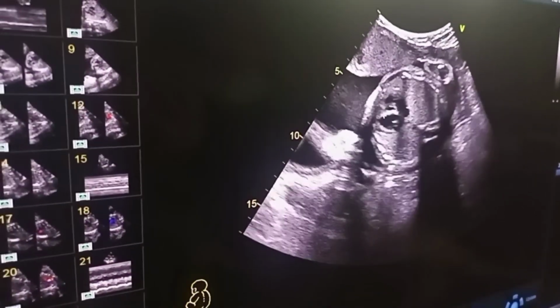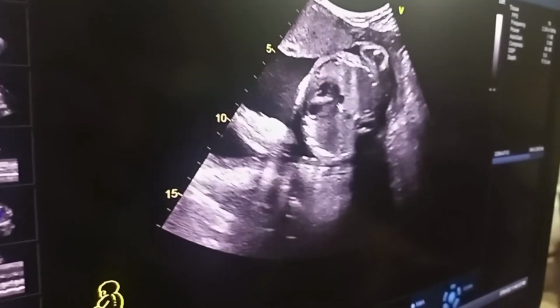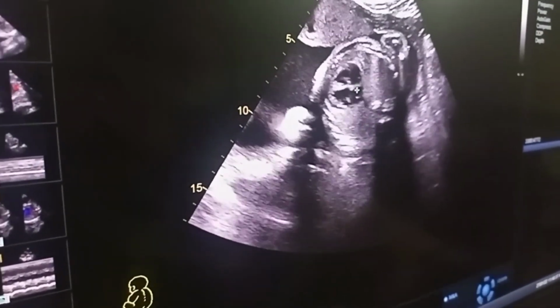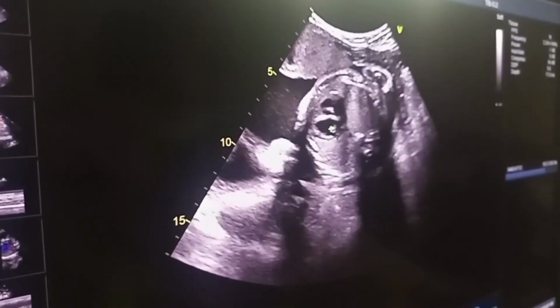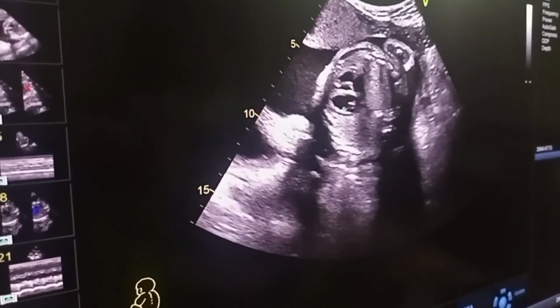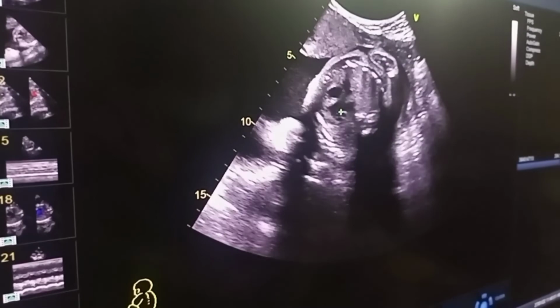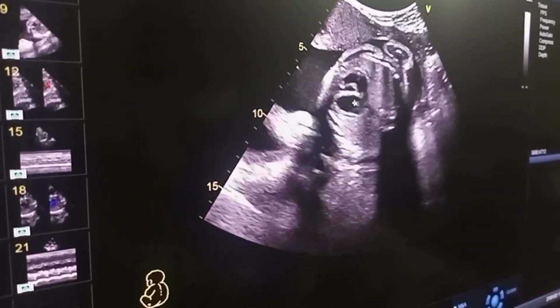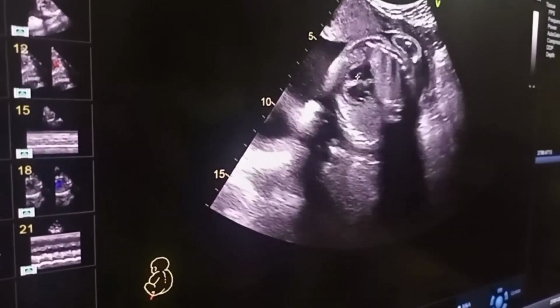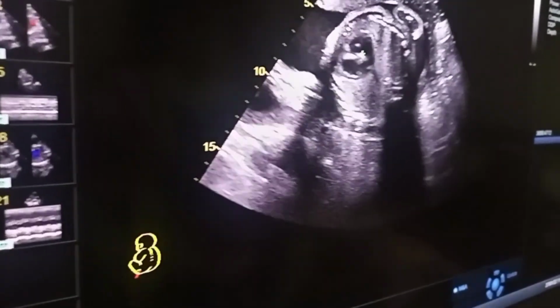So here is the four-chamber view. We can see the four chambers. These are the ventricles and these are the atria. How can we identify if this is the LV or RV or LA or RA? This is the LV, as it has a smooth line, and the mitral valve is above and away from the septum. Here is the RV. The RV is trabeculated, and here is the moderator band, and here is the tricuspid valve, which is septal attached and lower.